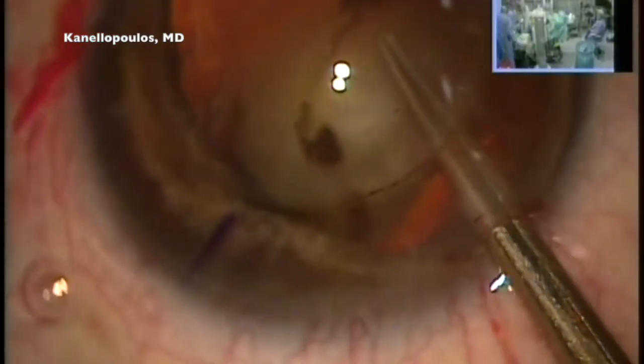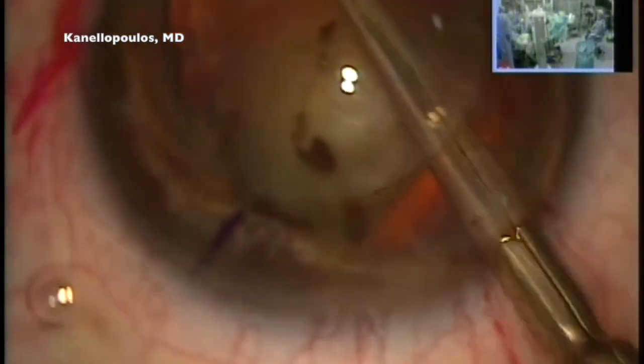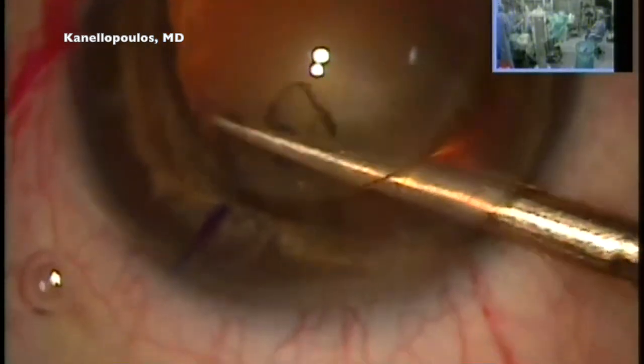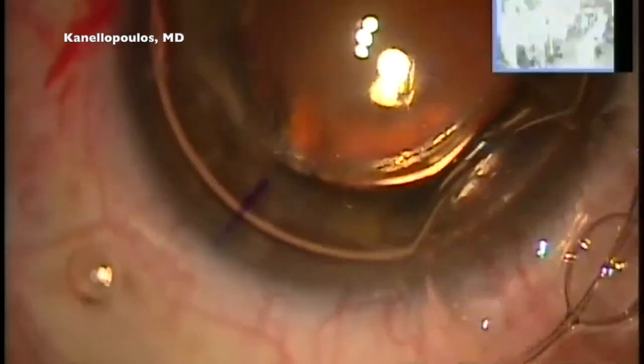So I'm identifying the membrane, bringing in my long Vannas scissors — see how it cuts and releases the tension that was there — and I'm removing this strand of iris connecting almost in the middle. Now I have a much better field.